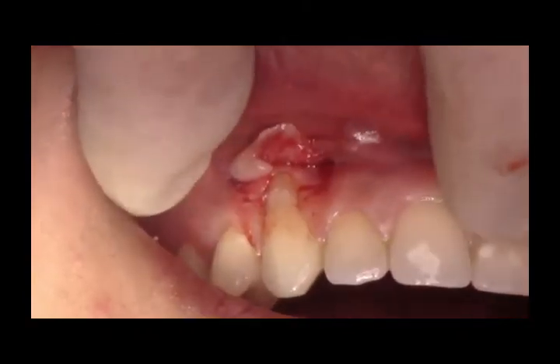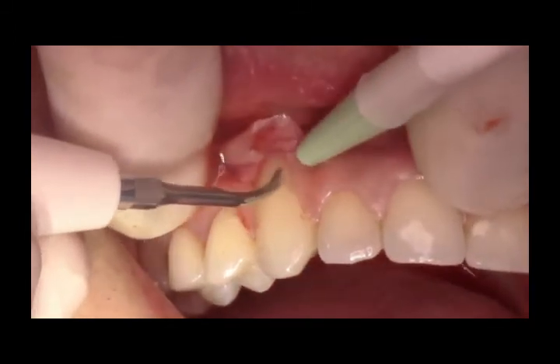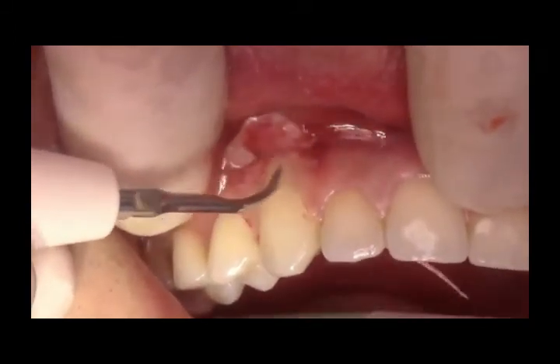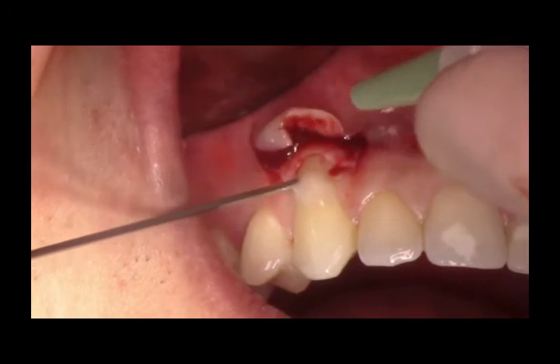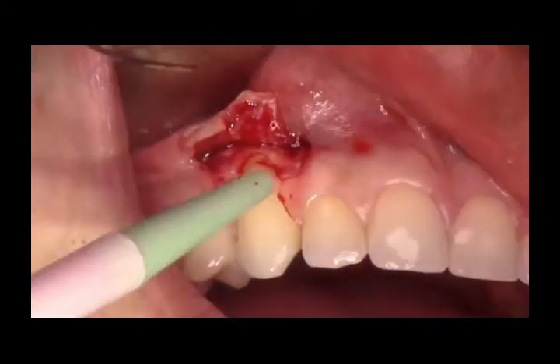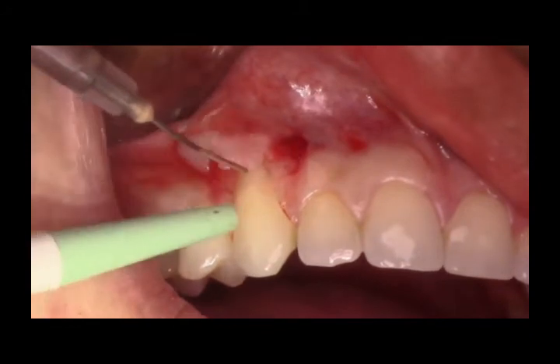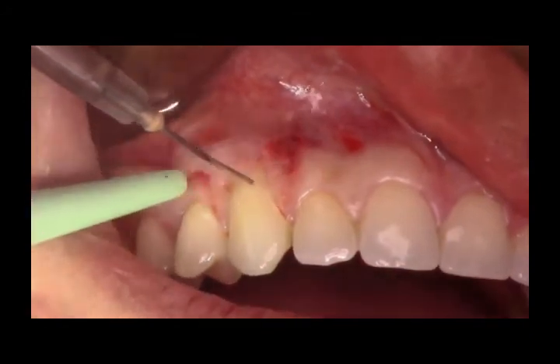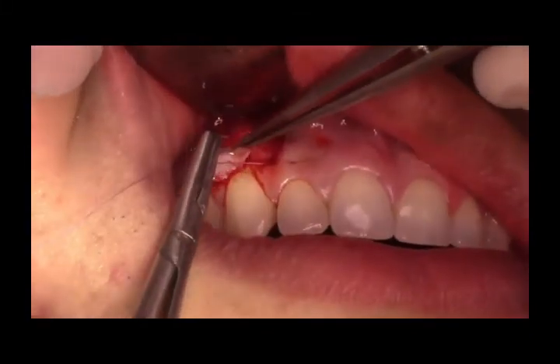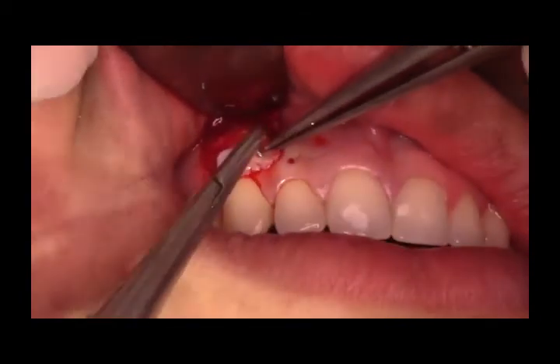The root surface is debrided with various instruments, and scaling is done to remove any attached debris. Root conditioning is done to create small porosities on the root surface. The connective tissue graft is then placed on the recipient bed and sutured.